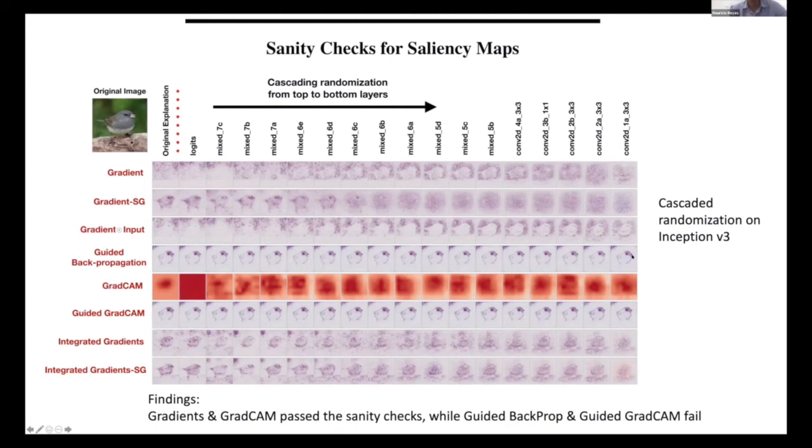And that's worrisome. That shows us that the saliency maps, although they might look appealing, although they might look sound, are biased by construction. So now we face this area of research where we want to validate the saliency maps themselves. So we have interpretability approaches to audit deep learning systems, but now we need to make sure that the interpretability approach itself is reliable.